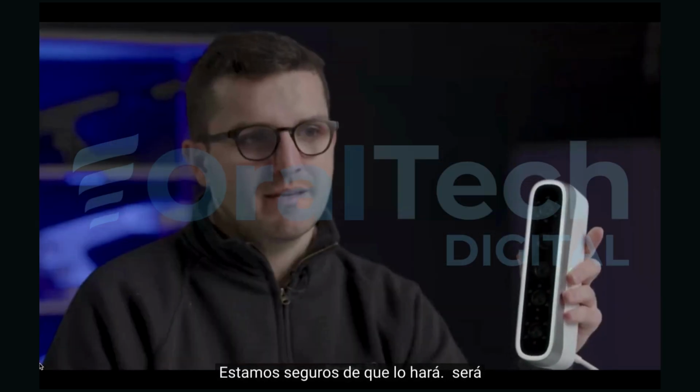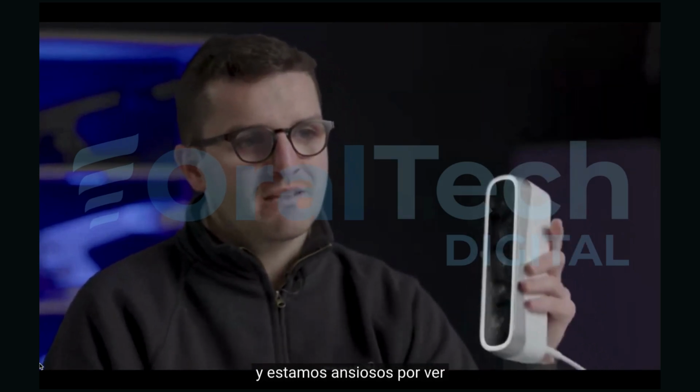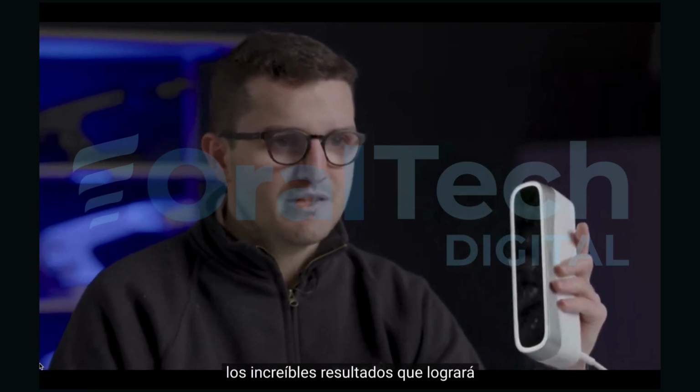As usual, the MetiSmile is incredibly user-friendly, efficient, and precise. We are confident that it will be an invaluable asset to your practice, and we can't wait to see the incredible results that you will achieve with it.